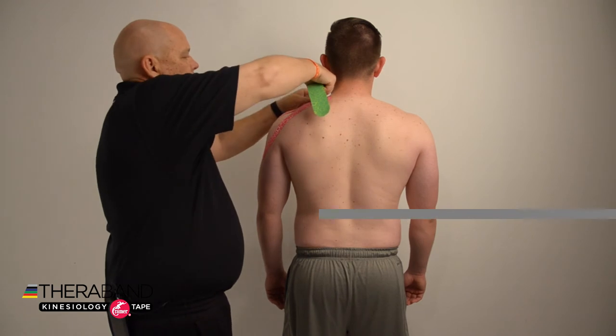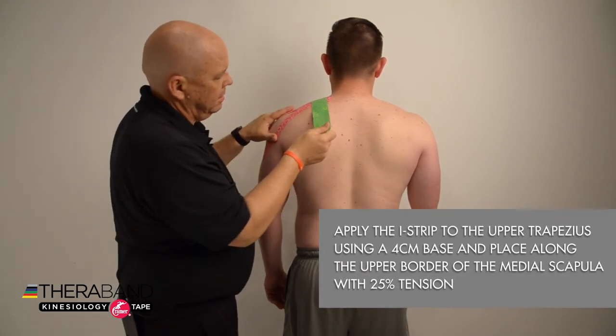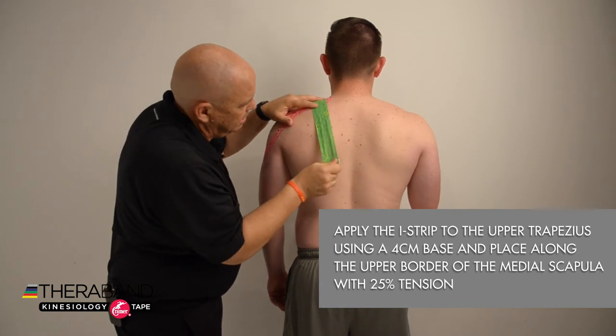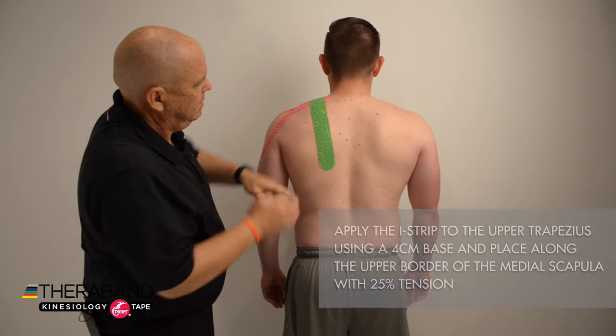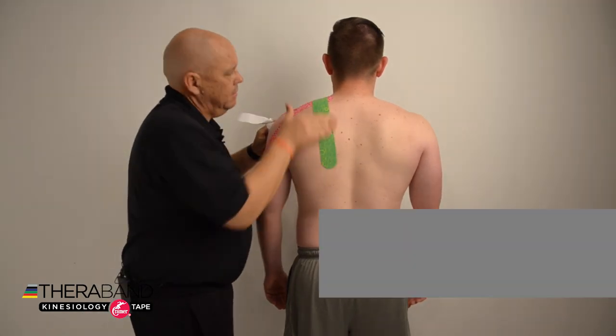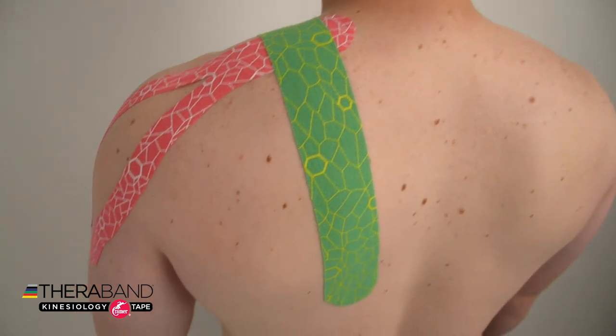For the next strip, the I strip, we'll remove four centimeters from one end for our anchor that we'll place right over the top of the upper trapezius. We'll pull down on that tape at about 25 to 50% as we place it just on the medial border of the scapula, then apply the base without any tension and rub the tape to activate the adhesive.